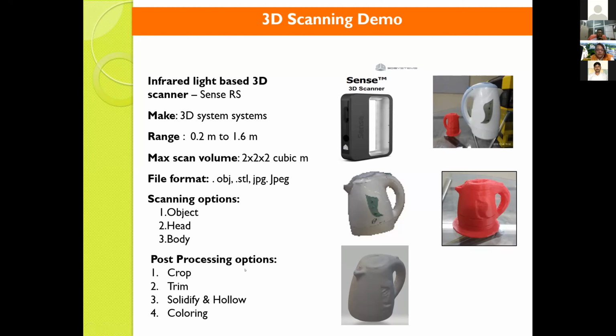Okay. Basically, this is the important feature of any lab scanner, dental or for engineering purposes, because we scan the outer area. Basically, it takes the data of outer surfaces. It does not go inside to see what is there. It is a surface scanner. Some of the lab scanners contact the surface to know where the surface is and then scan. But this is a non-contact type, and we can solidify it for when we go for, suppose, a tooth or implant.